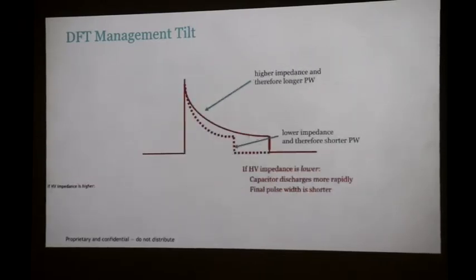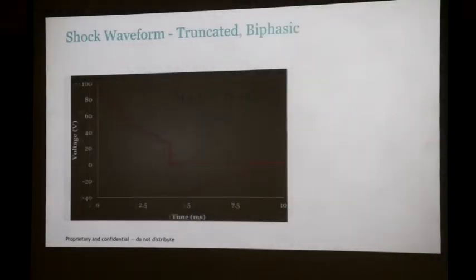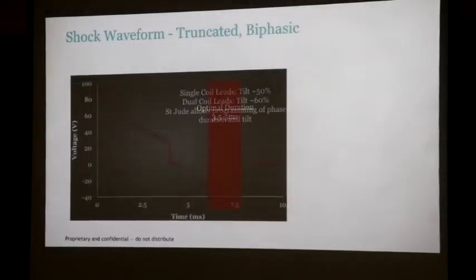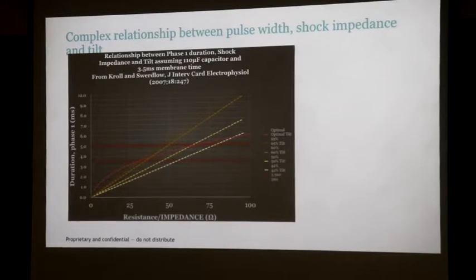Maybe I'll just draw a quick waveform. We can draw this for the time being. Too many lines here. I'm going to bring it on a little bit to this picture here. You want to squeeze the waveform, right? You want to be squeezing the defibrillator waveform. How do you do that? We just tell it.